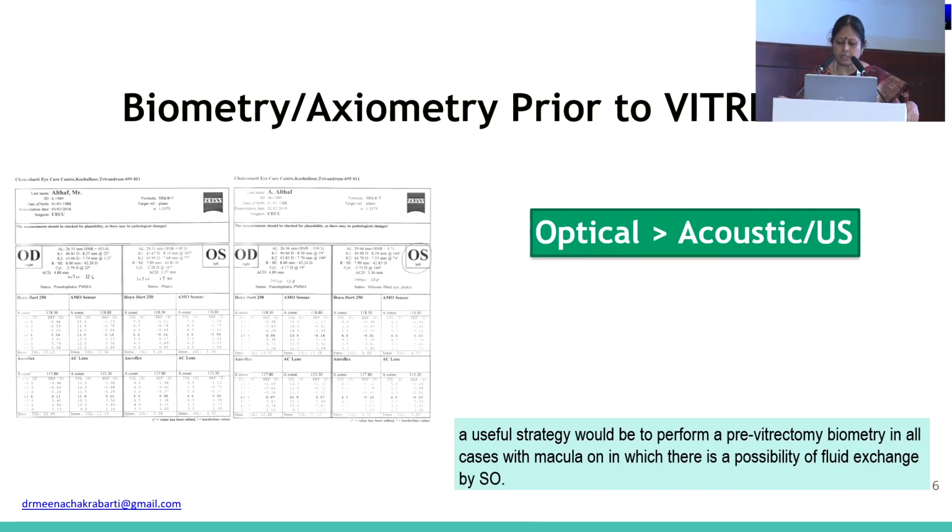The ideal situation would be to perform a pre-vitrectomy biometry in all patients who walk in for a vitrectomy, especially in eyes where there is a chance that a silicone oil tamponade has to be done.